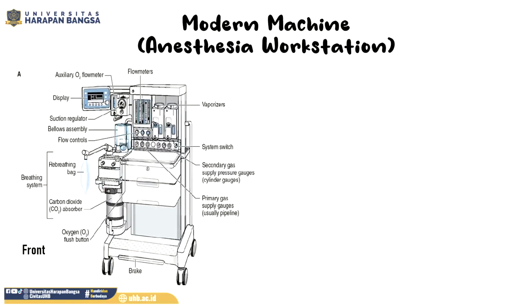Though a lot of changes have been made to the original design of the Boyle's machine, the basic structure remains the same. Now let's check the front part here.